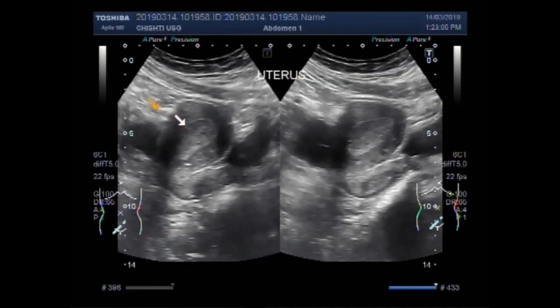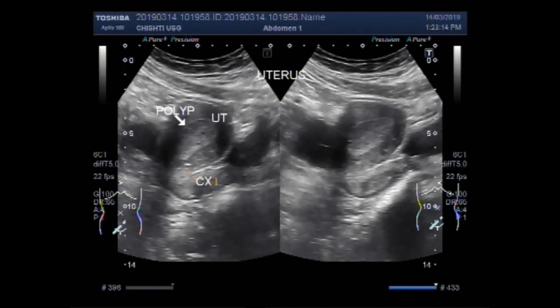This is the uterine polyp. This is the cervix. This is the urinary bladder. This is the left ovarian cyst.